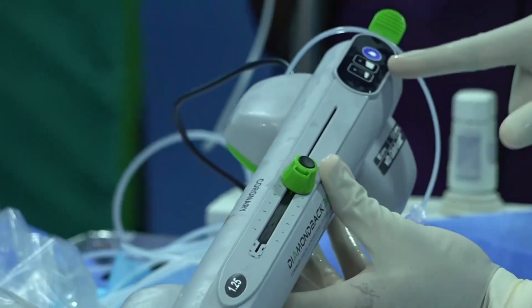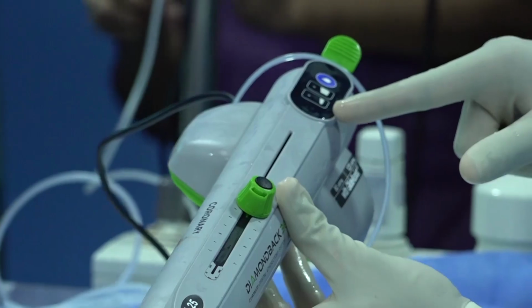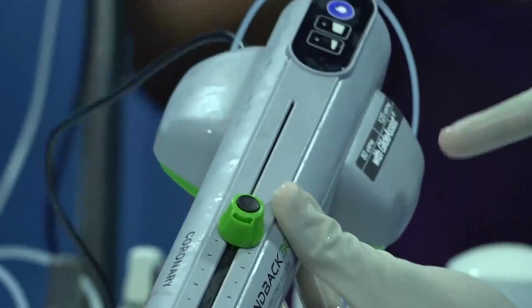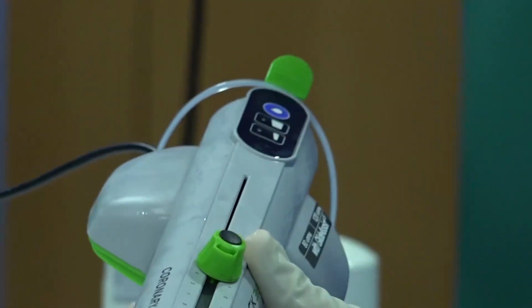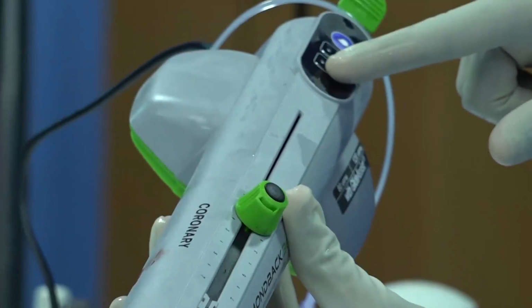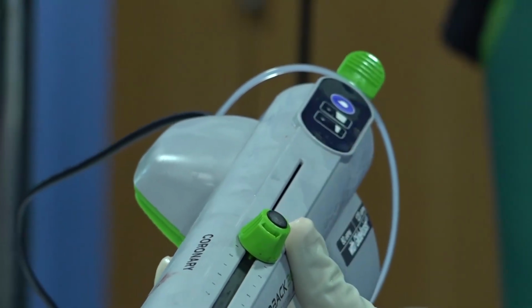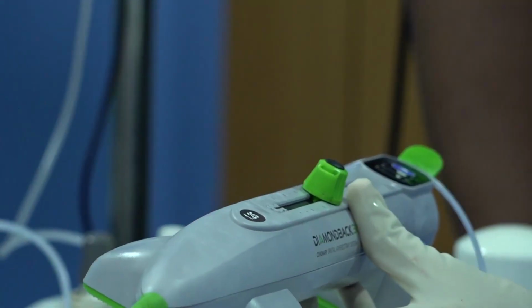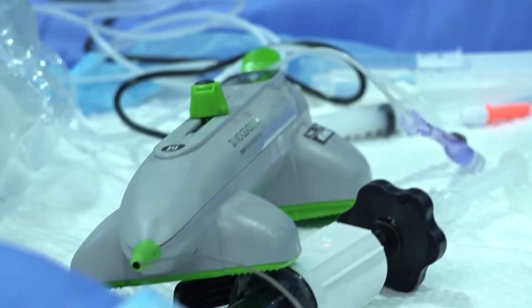Then we have two switches to toggle between. One is for low RPMs, and the other one for 120,000 RPM. Then we have the glide assist mode also. To go in and take out, you can go at 5,000 RPM. You just have to hold on to that for a while so that it becomes 5,000 RPM. Then again switch on, switch off button, and again the lock, again the brake. Okay, these are the things that we need to keep in mind.